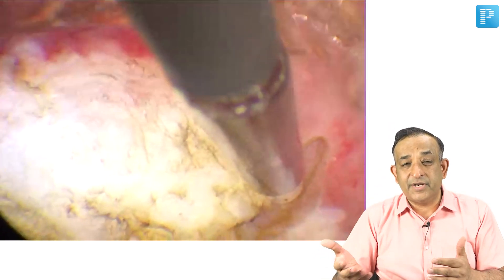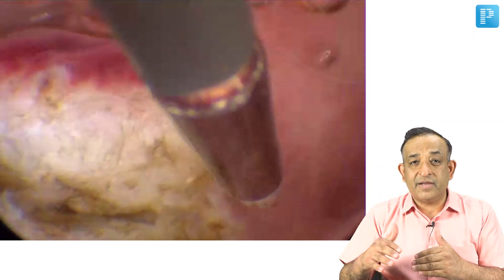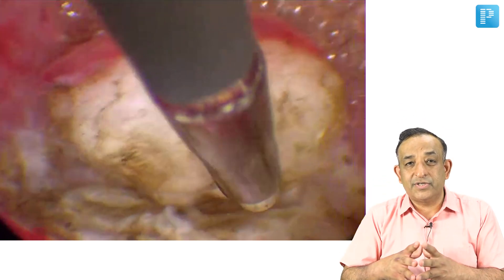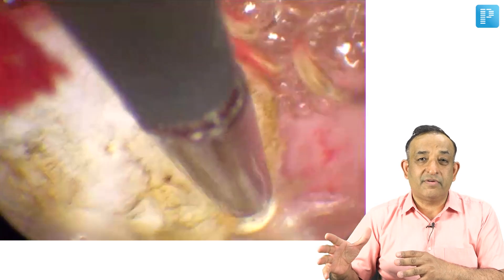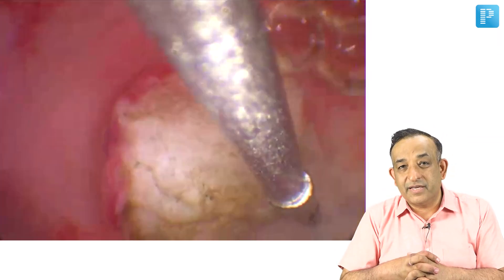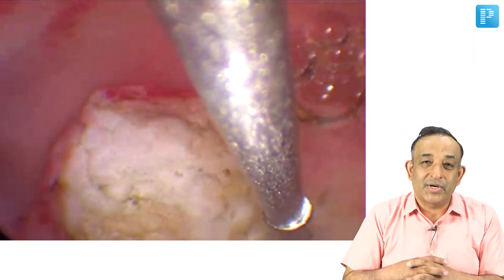This patient will bleed a little bit and we will take precautions to control the bleeding. Once I remove the fibroid I am using a scissor to snip it off. At the end of the procedure you can see the fibroid has moved away from its attachment and has now come to the mouth of the cervix, that is the internal os. I would then finally remove it with a sponge holder.